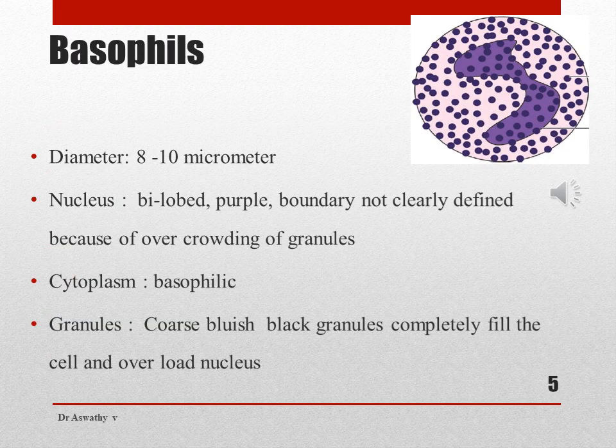Next, WBC is a basophil. So basophils are least in number in differential leukocyte count. It is only 0 to 1 percent.